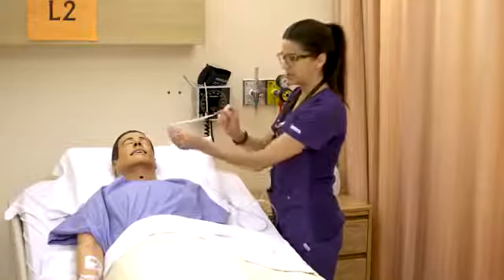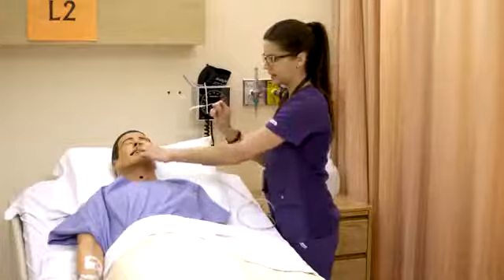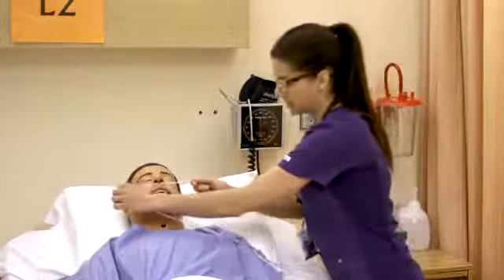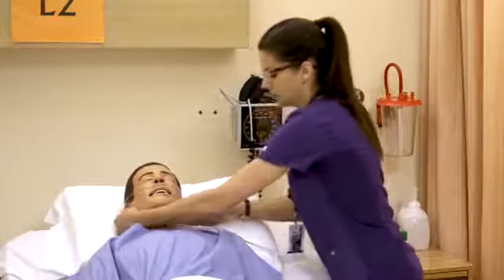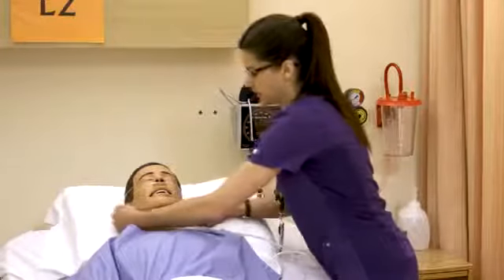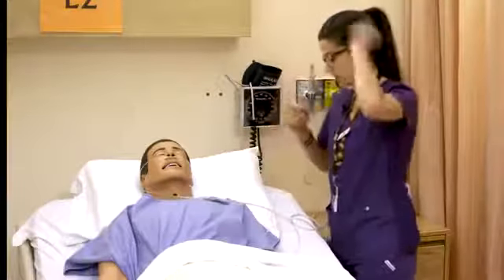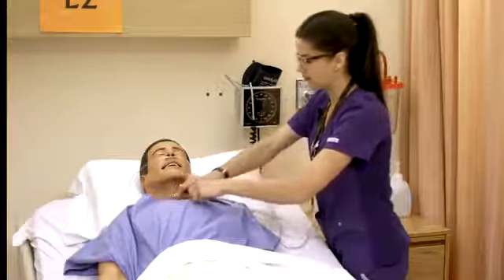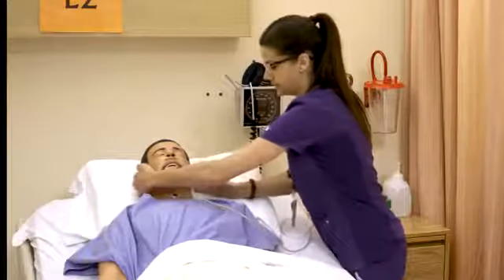And like we said, the prongs go in. Sometimes there's also a ledge here, and that ends up sitting on the person's upper lip. So we're going to apply it to our patient, putting it in, and then it goes over their ears, and I call it a cowboy hat mechanism. Just like that. On Jake, it doesn't sit super well because his ears are attached to his head, but on a real person, it can just easily go around their ears. And then you can tighten this little piece, and it helps keep it secure on a real person.